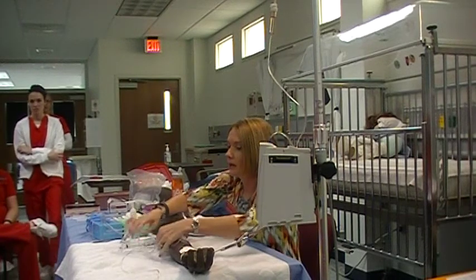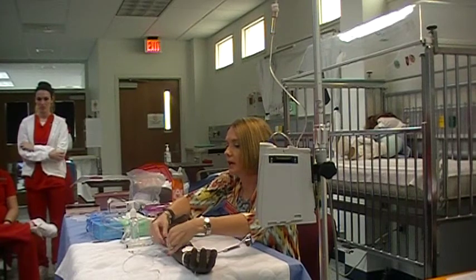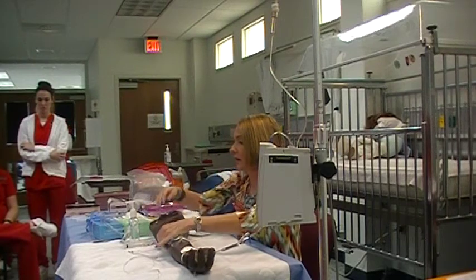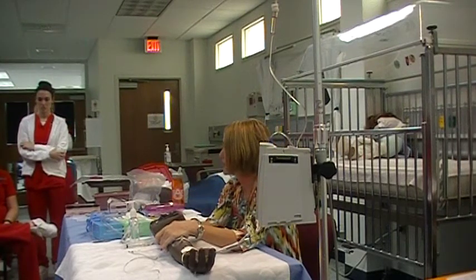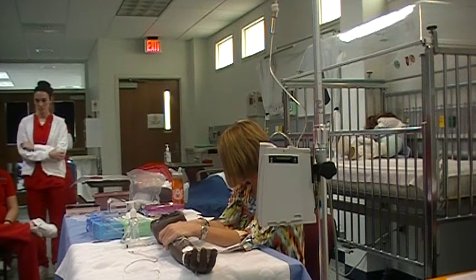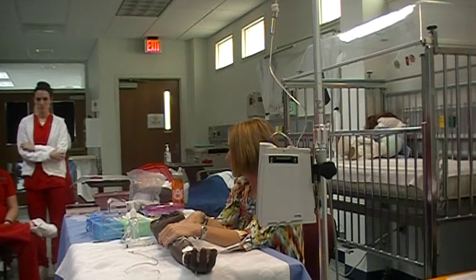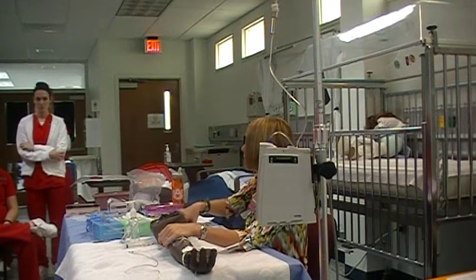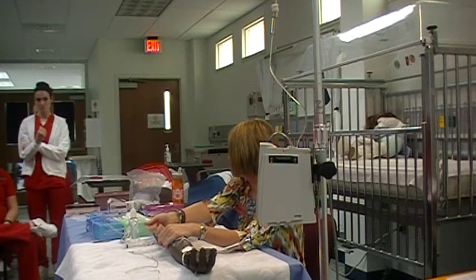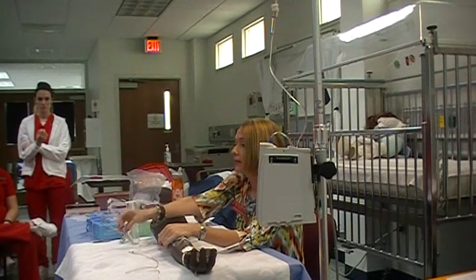Okay. Now, the other way you could get it is if you just have it in a saline lock situation where you're here. Okay, and the same thing kind of, we've got to verify placement. Again, all of our identifiers, everything we did before, but with a saline lock, you would just clean the port, inject the medication. Again, we're making sure that we have a patent IV first. Okay, that's part of that top part. We want to make sure every time we do our flush, we make sure we've got a good line. We give our medication at whatever speed it is that we need to give it. Then we want to flush.